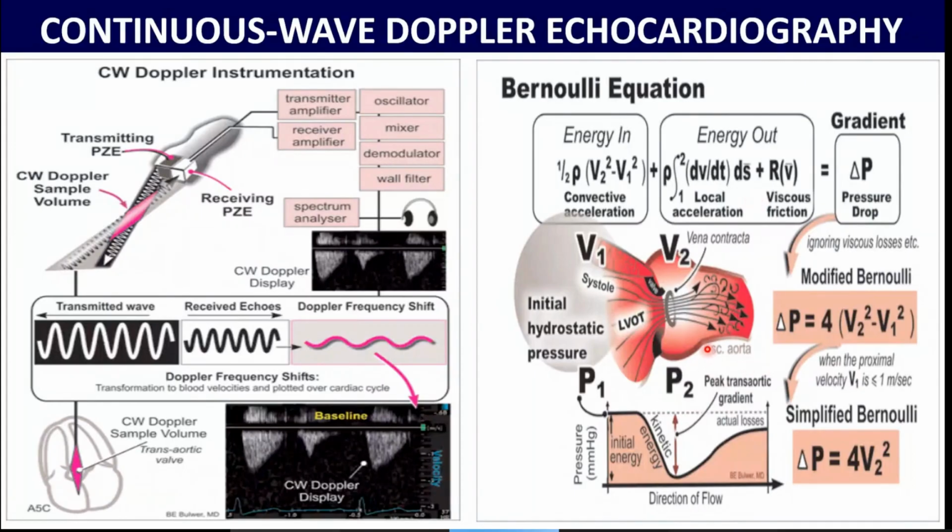This is especially true in an aortic root which is narrow, less than 2 centimeters in diameter. If the aortic root is wide, this is not a big problem. But as I said, the first reason for increased pressure gradient during echocardiography will still be present there.